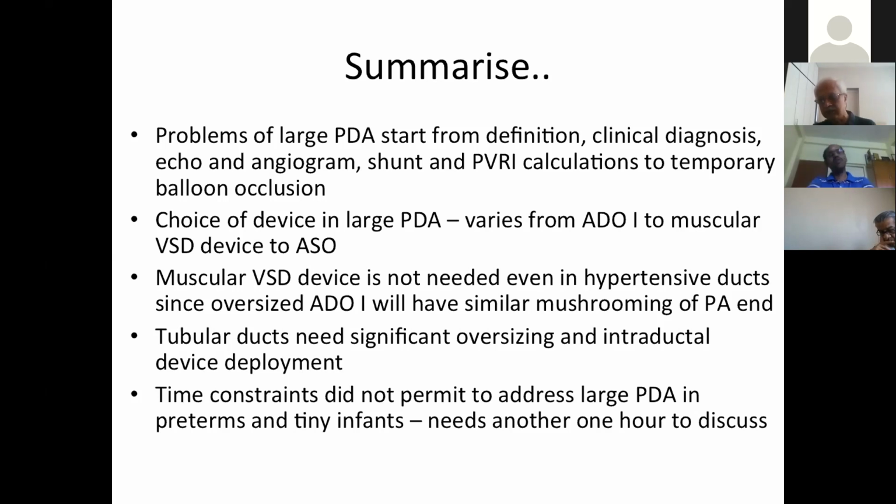Yeah, some of the patients between 2000 to 2010, when we had adopted the strategy of closing PDAs with the data obtained from balloon occlusion and then leaving them with very minimal medications or only with sildenafil, there were patients who had come back on follow-up and had presented with much higher pulmonary artery pressures than what they were originally having.